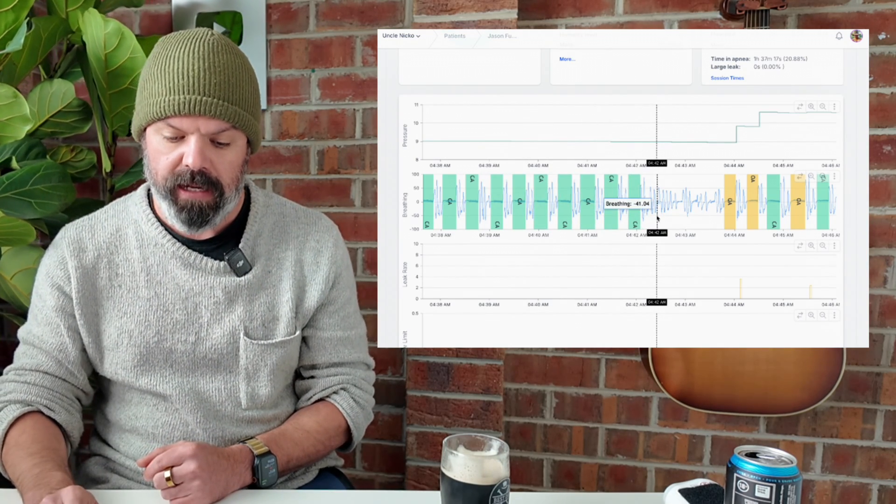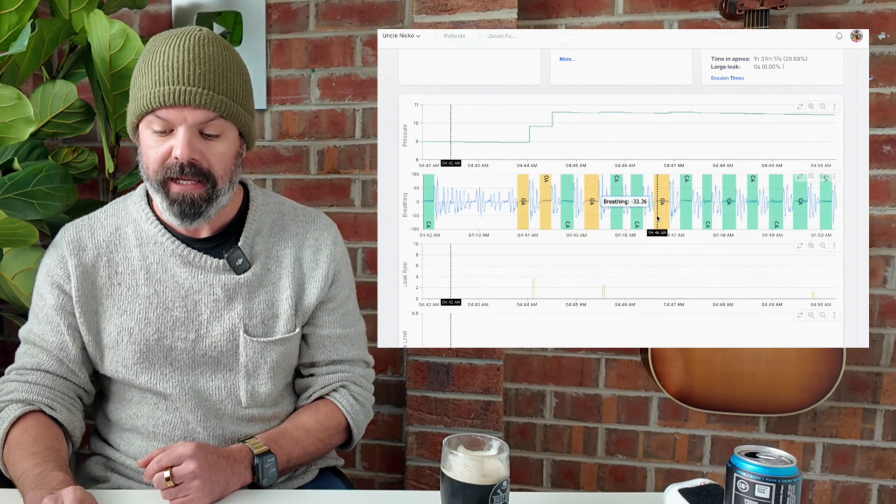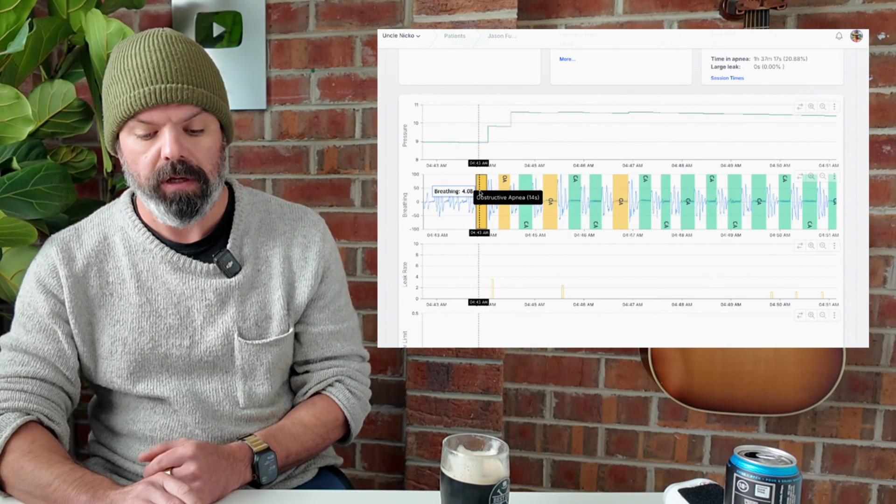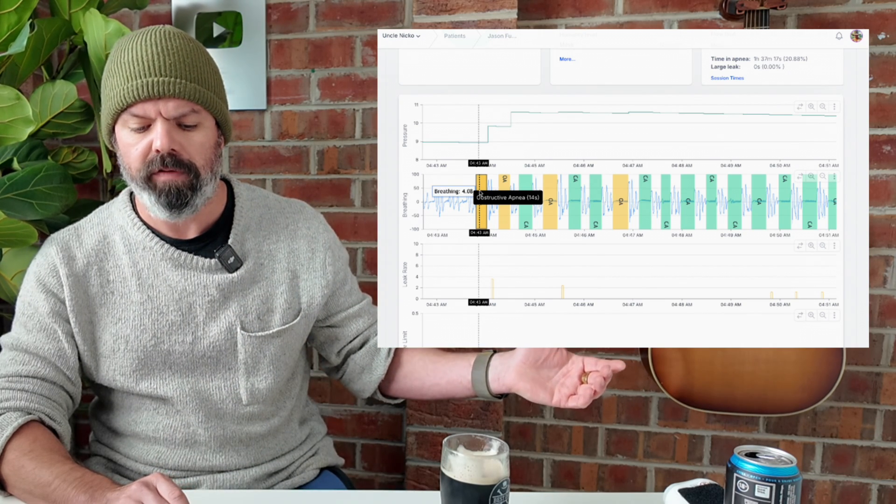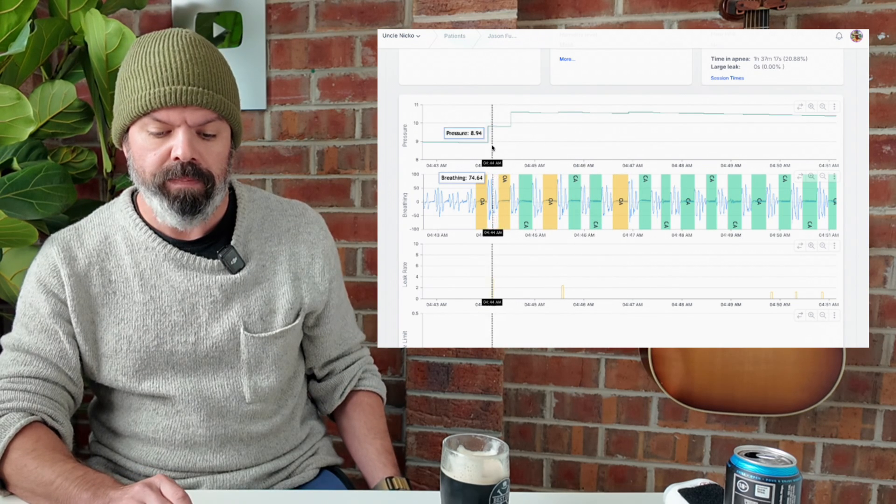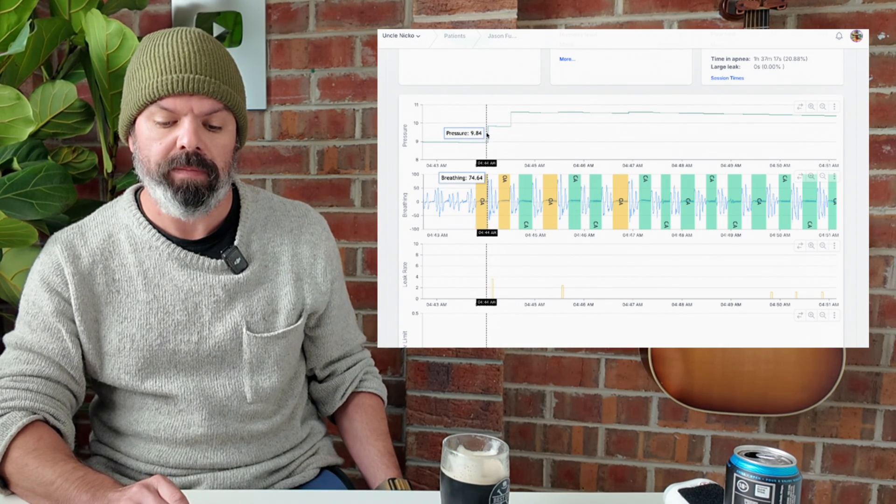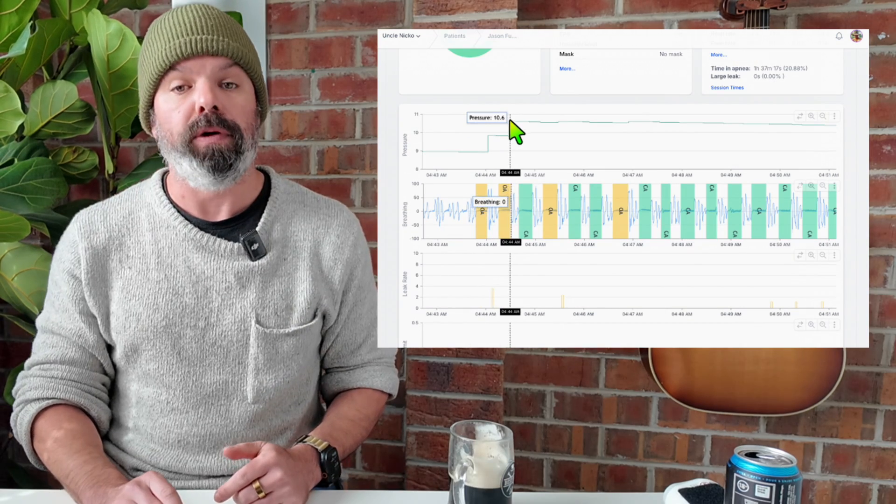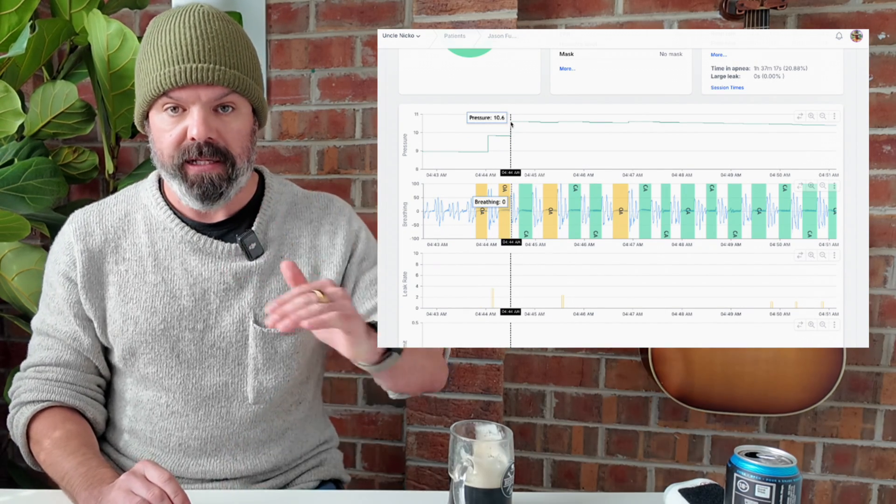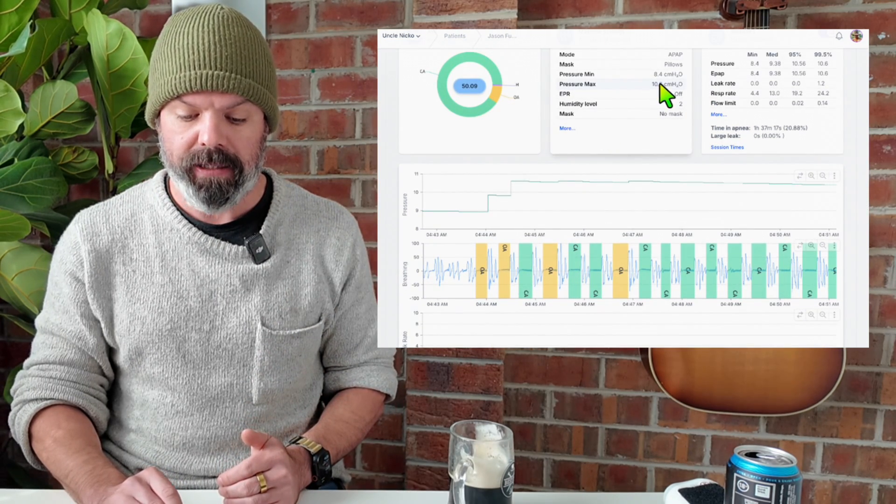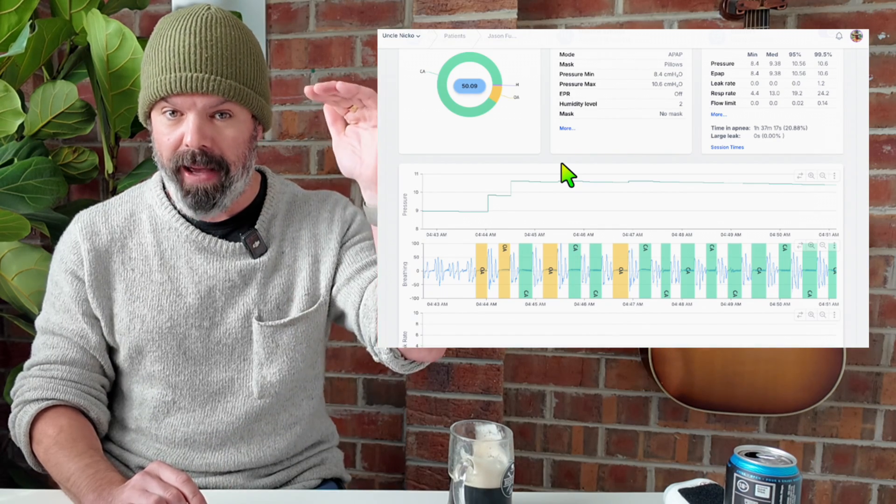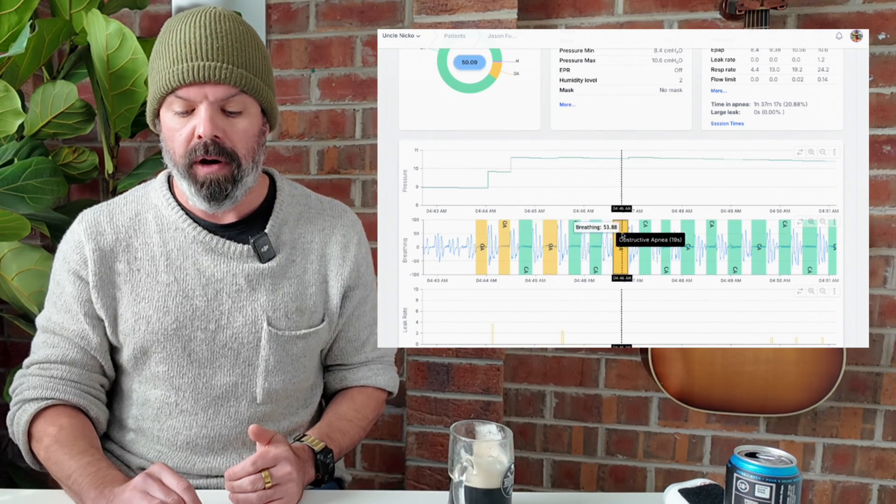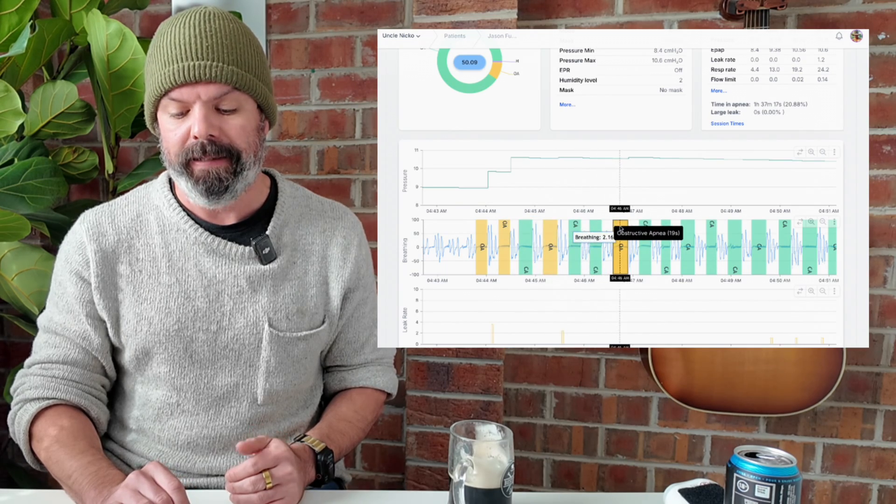But you'll see here all of a sudden into the mix, we have these obstructive apnea events, these yellow flags, one here, one here, one here, and we get these great big jumps in pressure. One centimeter jump there, one centimeter jump there up here, 10.6, which is as high as his device can go. 10.6 is the max. Probably lucky that he's got that max of 10.6, otherwise it might've gone much higher with these two OA flags here.